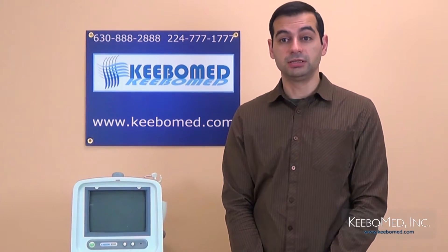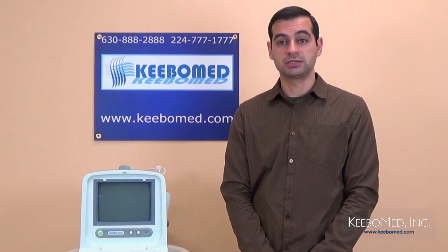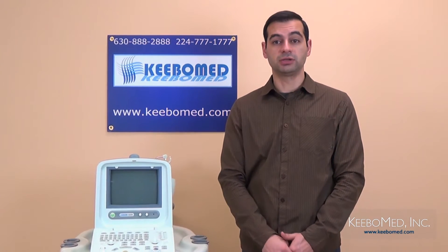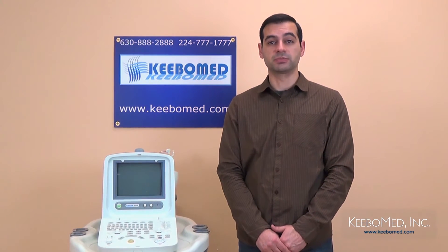This is Timothy with KeeboMed and in this video series we will describe the contents of the Chison 8300 User Manual. Specific details that are important to know about the 8300 and also how to operate it will be explained and shown for reference purposes.